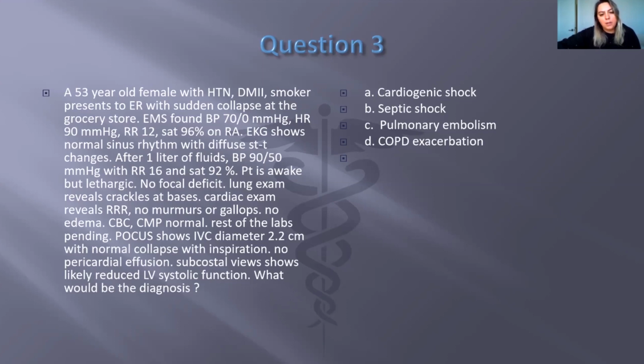So next question is, do you normally use phased array or linear probe for lung images? We use phased array.